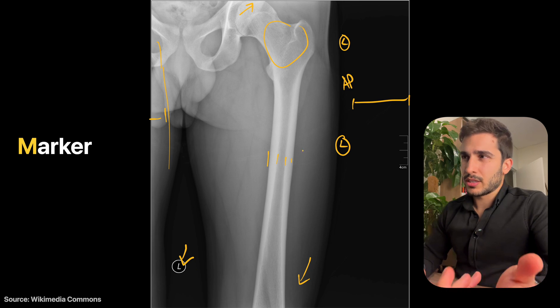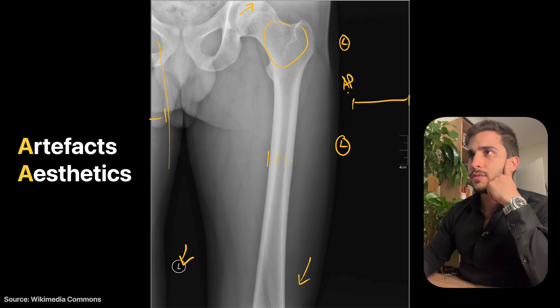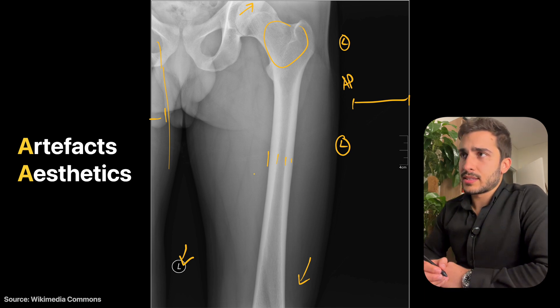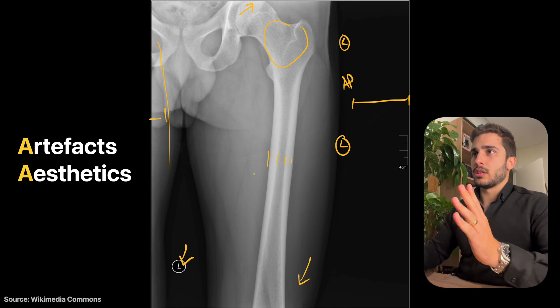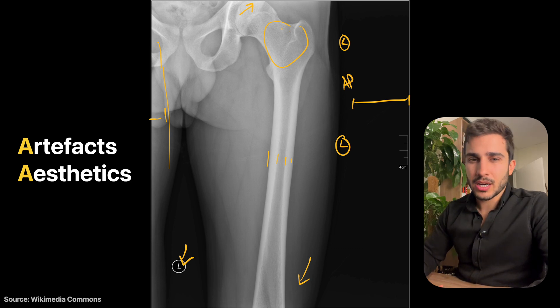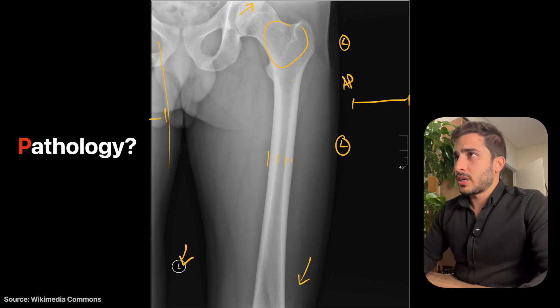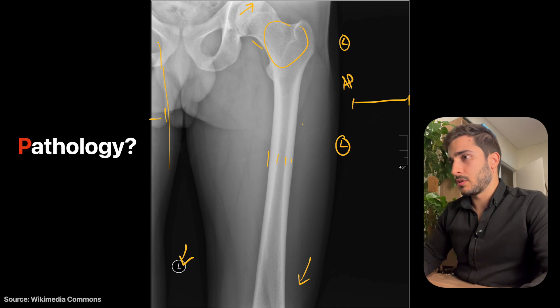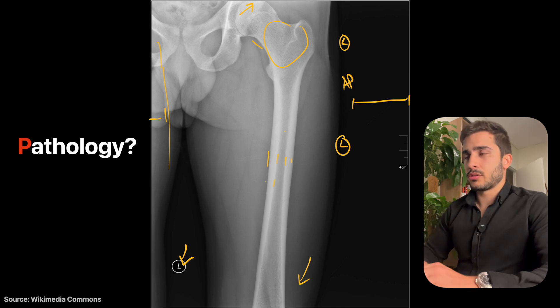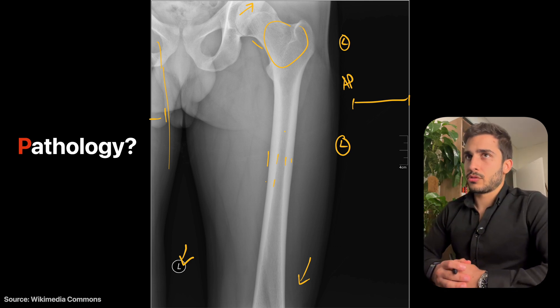The marker position isn't necessarily wrong, just a change would have been ideal. Aesthetics and artifacts: there are no visible artifacts and the aesthetics are really good — everything is in line and the anatomy is clearly visible. The only improvement would be centering slightly higher to include the full hip joint. No patient name or identification is visible for anonymous reasons. No pathology is seen — the neck of femur and long bone look quite good, with very thick cortices.